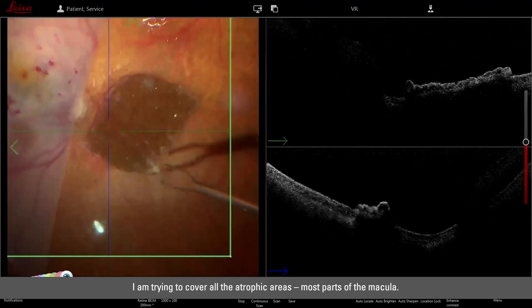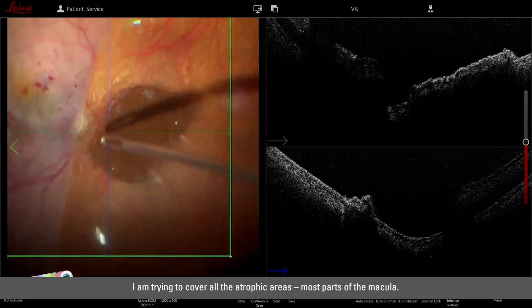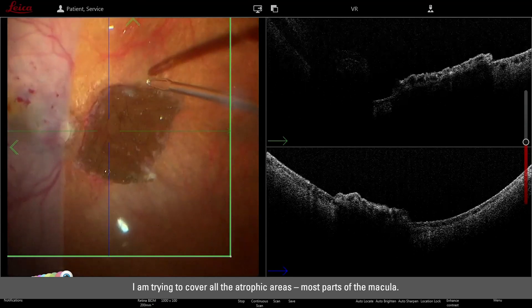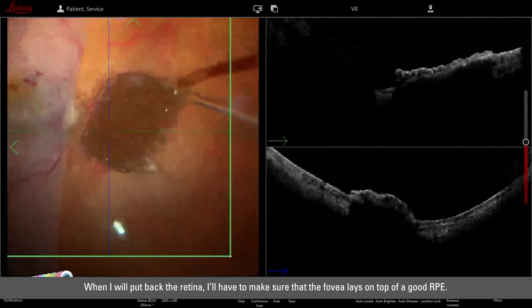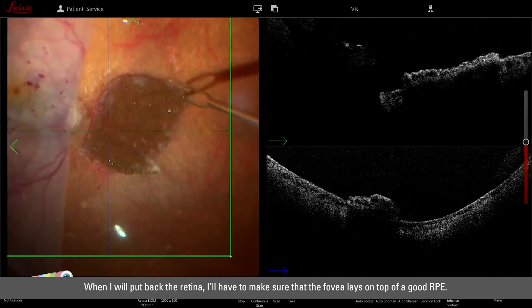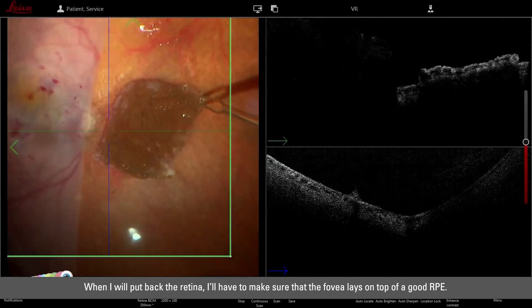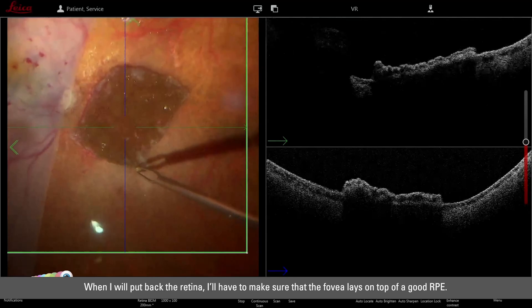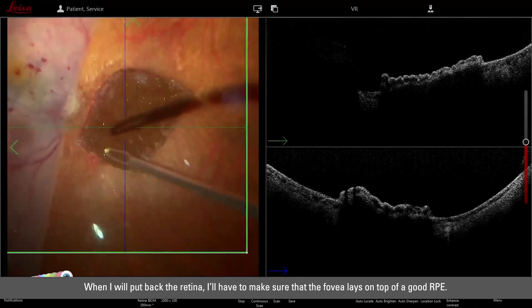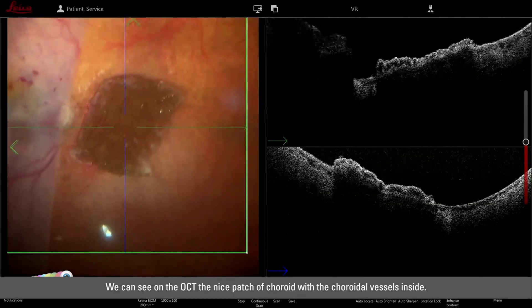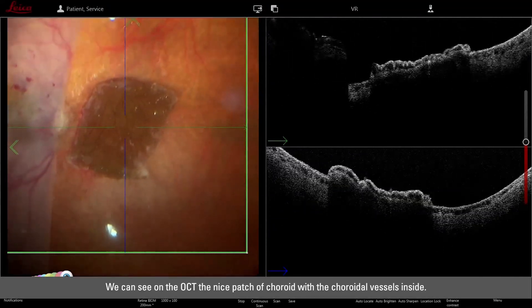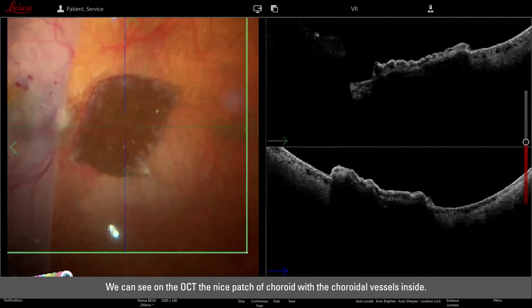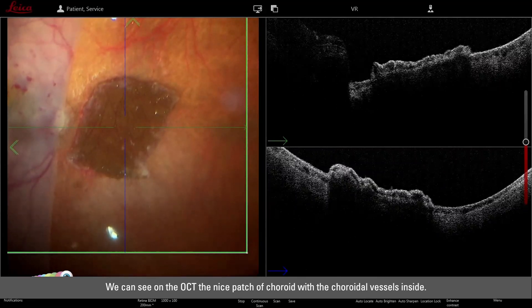I'm trying to cover all the atrophic areas, most part of the macula, and when I put back the retina I will have to make sure that the fovea lays on top of good RPE. On the OCT you can see the nice patch of choroid with choroidal vessels inside.